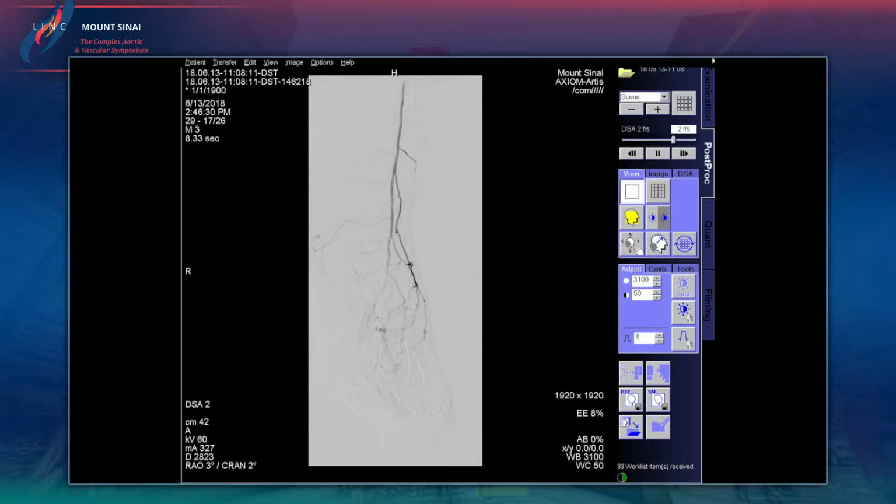PK, I think this does not sound like a huge ulcer. It sounds like something that has just reemerged due to restenosis. There are some critical lesions in that AT. I would favor just doing that. I don't disagree with seeing what the foot looks like, how much of the arch lights up after you do that, but I'm suspicious you won't see much more than you're seeing there.